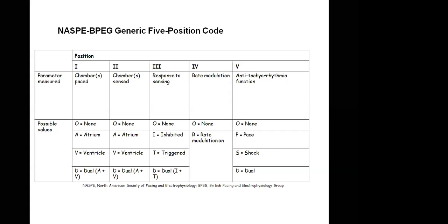When the patient is going for surgery and you're going to use a diathermy machine, the diathermy machine generates electrical activity. I'm sure we've all seen the diathermy pen before, used to coagulate and to cut, that surgeons use in the theater. Dr. Julius, you following that? Yes, I'm following. So it generates electrical activity, and the pacemaker lead can think that that is the intrinsic electrical activity of the patient. Are you getting me? It will be inhibiting pacing until the patient goes into asystole, because it thinks that the electrocautery activity is the patient's electrical activity.